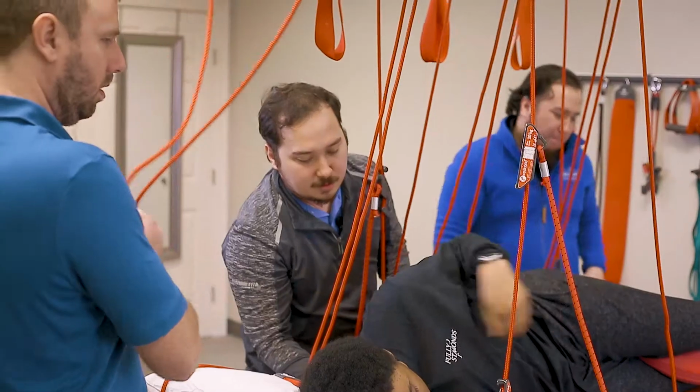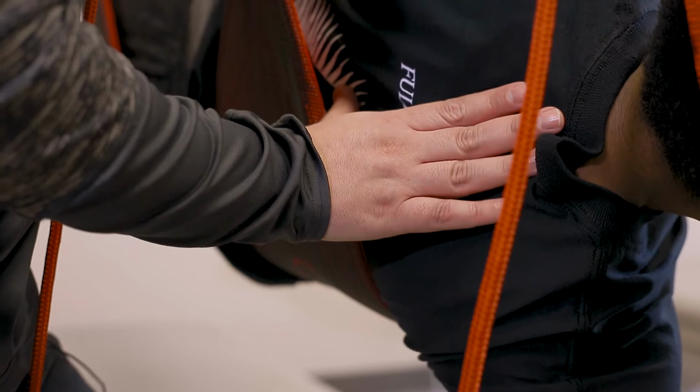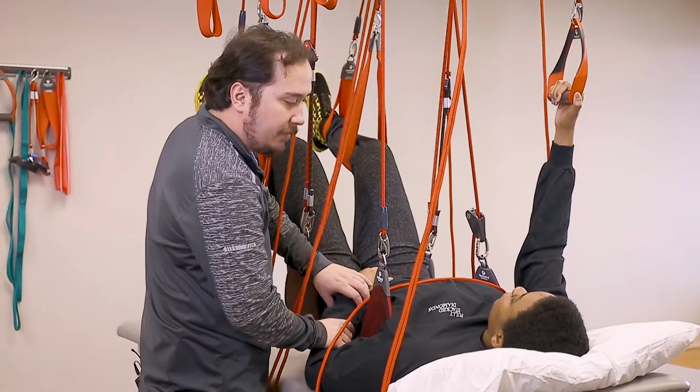The red cord system that we utilize is really good because it allows us to strengthen the muscles that have become elongated along the spine and allows us to stretch out the muscles that become shortened. And it really allows us to maintain that neutral position that we're going for after the treatment's over. I'm going to position your hips. Make sure to tell me if there's any pain.